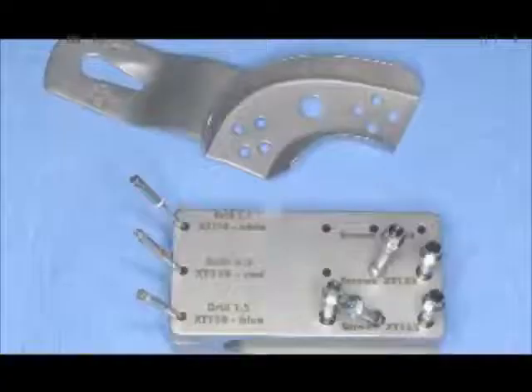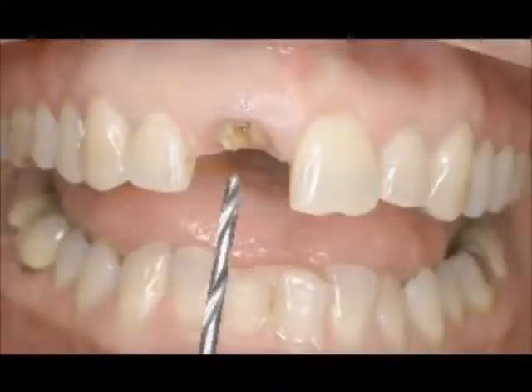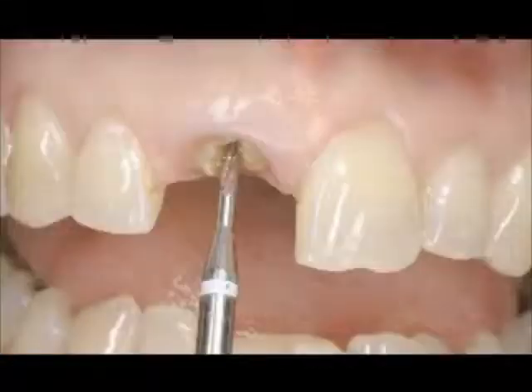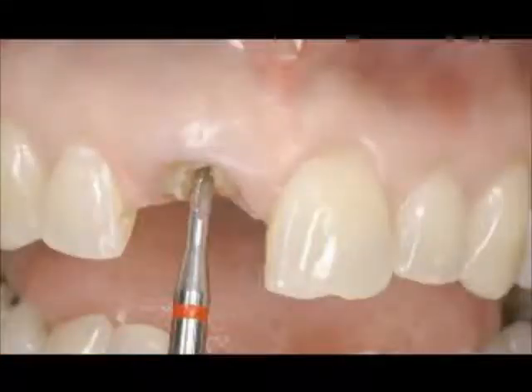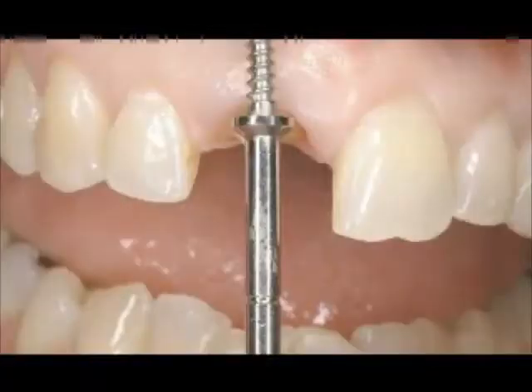The first thing in replacing a fractured tooth is to really get the tooth out with minimal trauma to the surrounding bone. One of the ways that we like to do this is with a device called an Easy Extractor from Titan Instruments. And what we do here is we time the extraction screw.